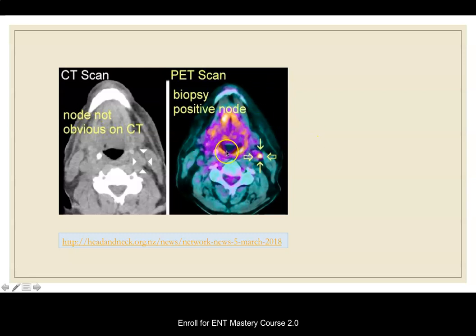You see that this is a radioactivity sort of a thing. It is very bright and fluorescent looking. So it is something like radioactivity, and radioactivity is used in PET scan and not in functional MRI. So this way you can distinguish if you get 2 pictures, one of functional MRI and one of PET scan. And believe me guys, they keep all such pictures for your DNB OSCE.